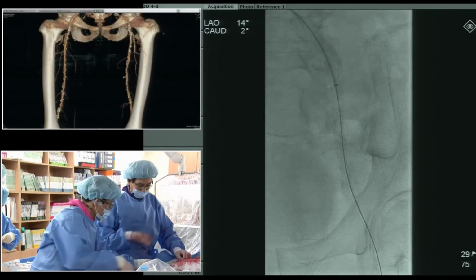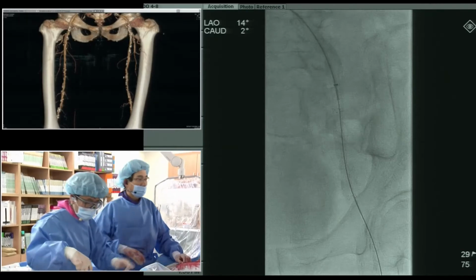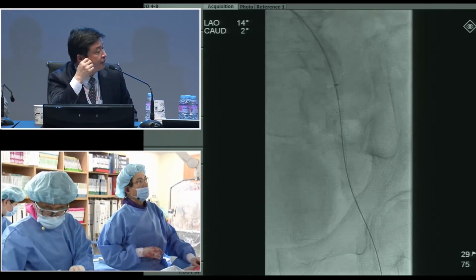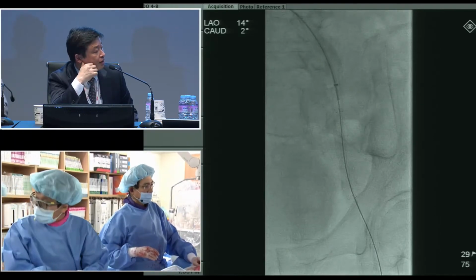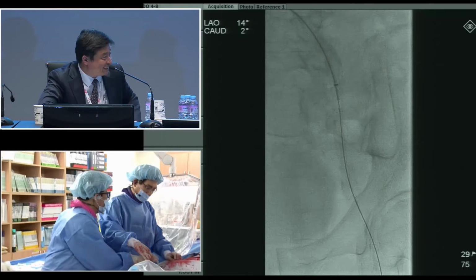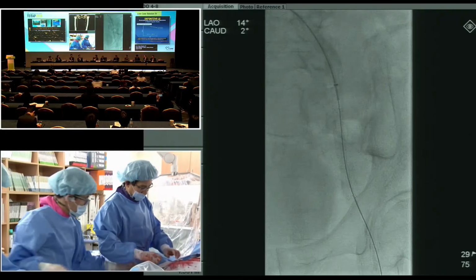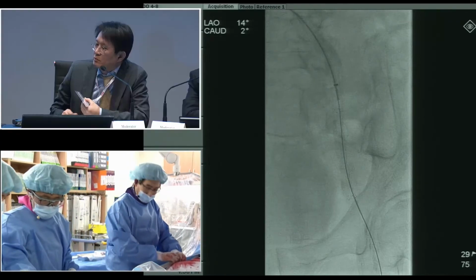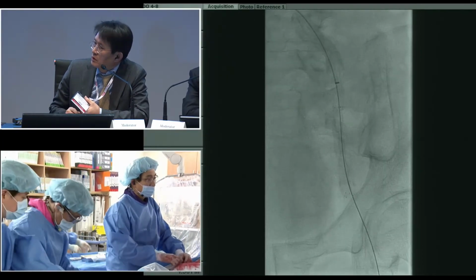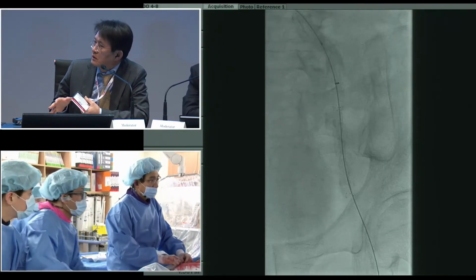Usually the Epic has the strongest radial force for this Korean stent. And what's your preferred stent for that? That is company data, not actual data. So I usually prefer this kind of region. I usually prefer the Smart stent because I have a lot of experience.